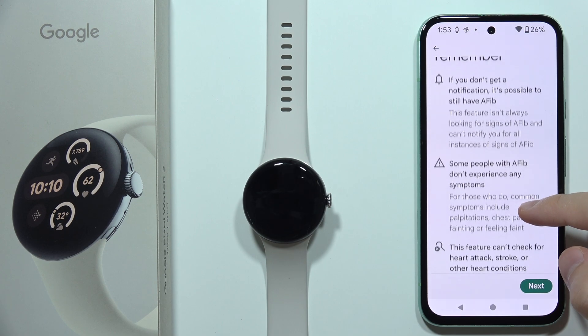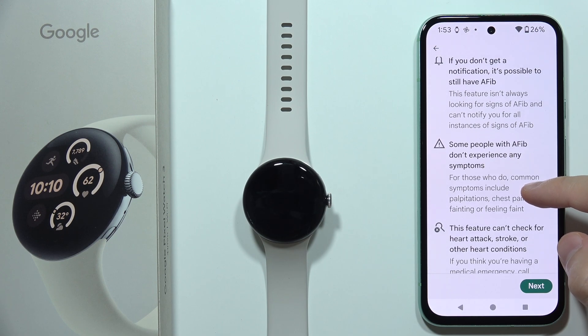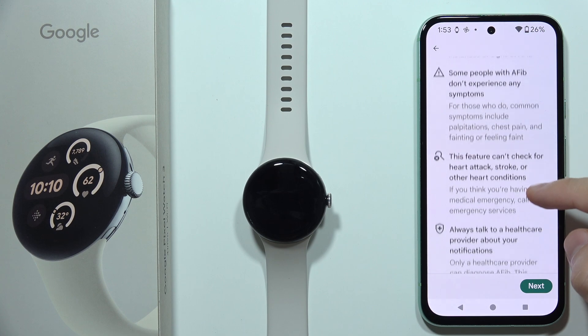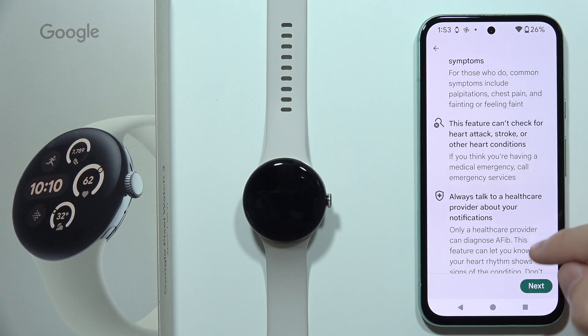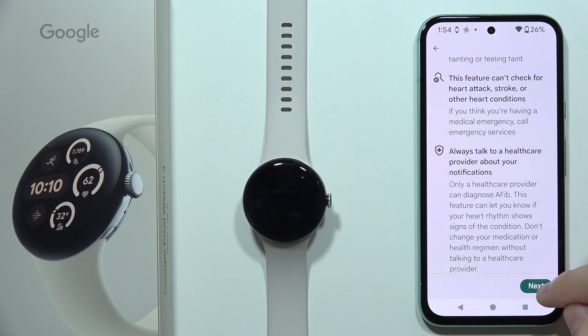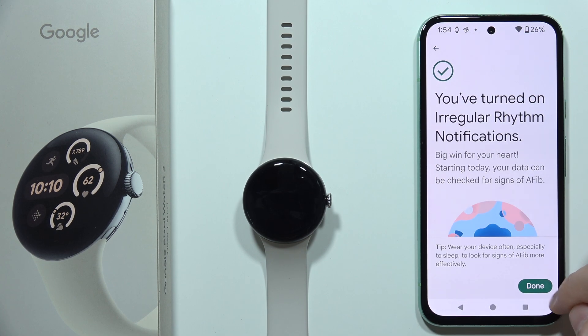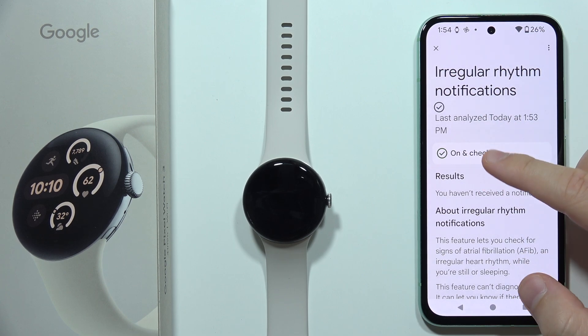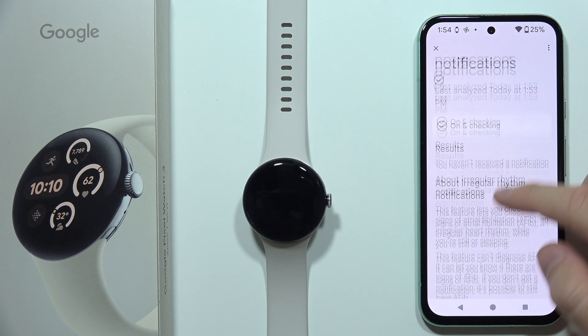There are four things to remember. Click Next in the right bottom corner, and as you can see, the function has now been turned on.